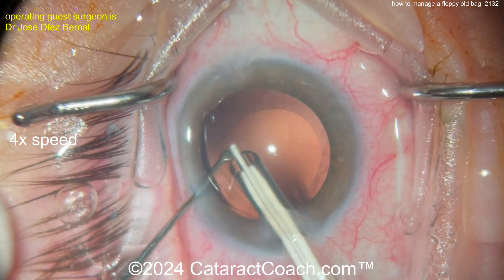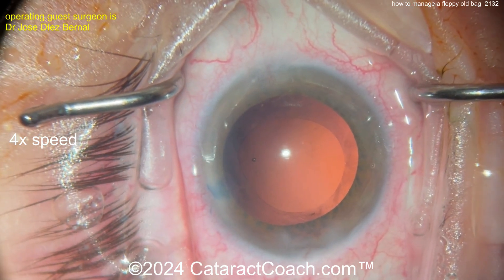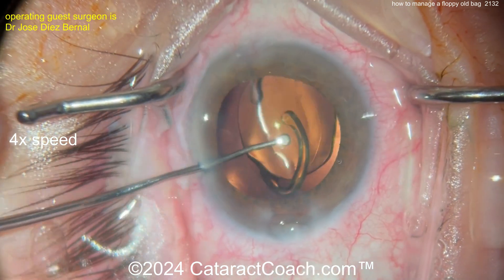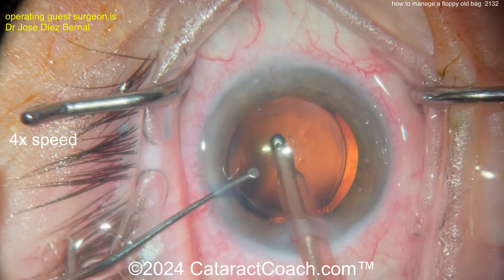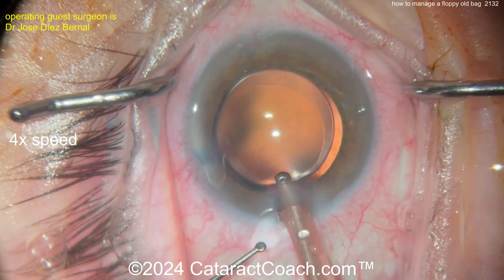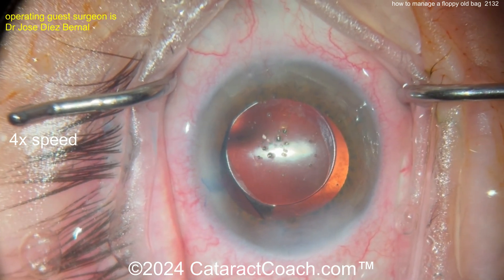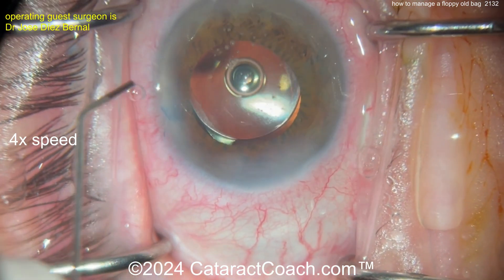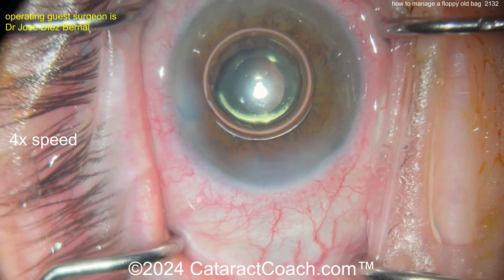Now it looks a lot better — the rhexis is now a lot rounder, like it was at the beginning of the case. For IOL choice: a single-piece acrylic lens in the bag — you can certainly do that too. This is a tough, stressful case. This is the kind of case where you tell the patient, 'You better appreciate the surgery, because your surgery took a week off my life.' I would prefer a three-piece lens in the sulcus with optic capture, but this is certainly very reasonable. Watch this patient in the post-op period — you may need to do something about the zonulopathy in the future should it get worse, such as suturing the CTR to the eye for more stability.